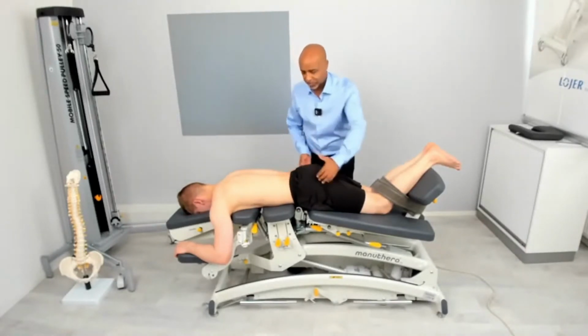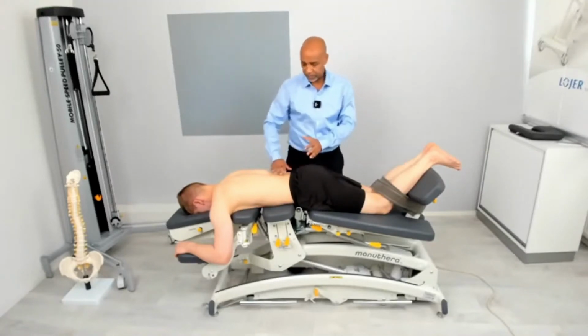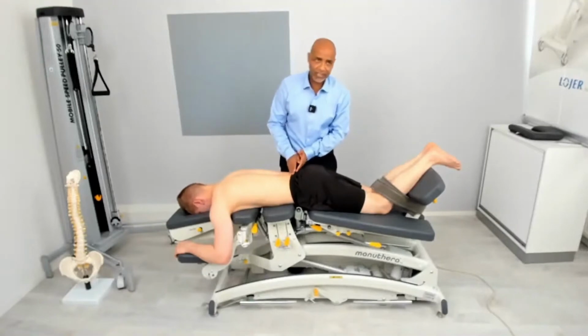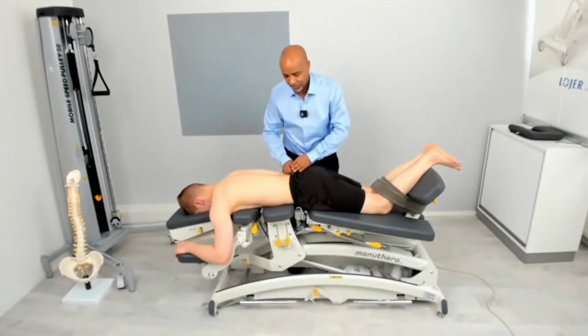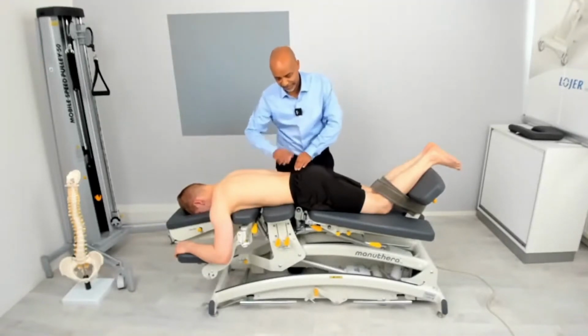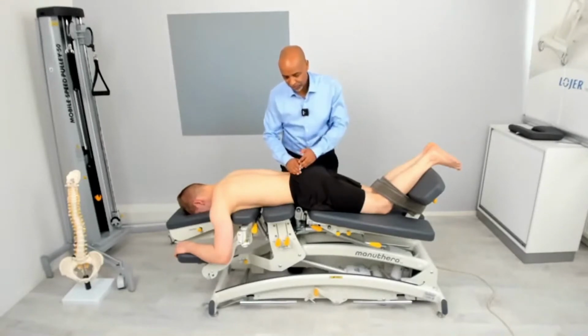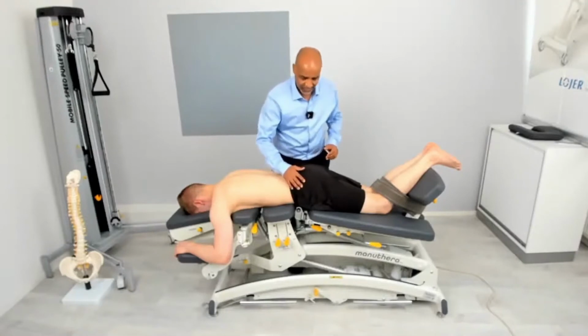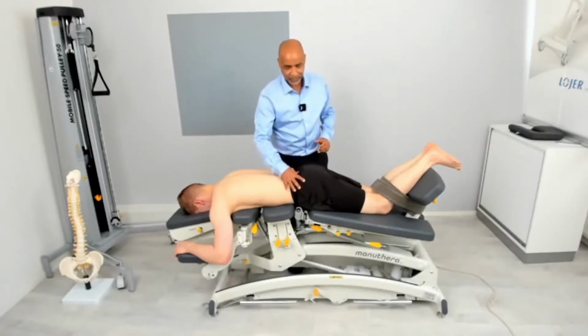What is the second chain of, now we have completed the upper muscles, we have gone between the interspinous ligaments, and then we just went into decompression of the spine in tilting. Now we're doing the rotation of the SI joints. And finally, we're thinking about also what else is causing this back pain.